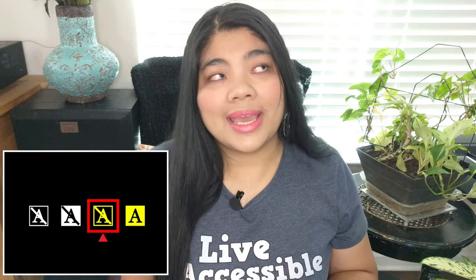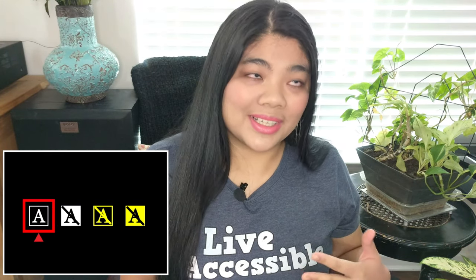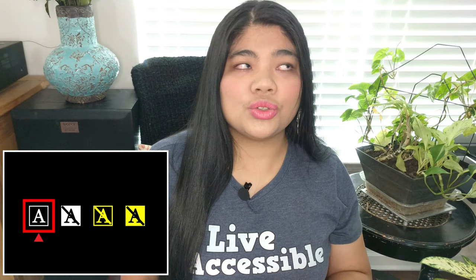For example, if you never use the black on yellow or the yellow on black, you can disable those. And that way, when you cycle through all the different color filter options, you don't need to cycle through the ones that you don't use.